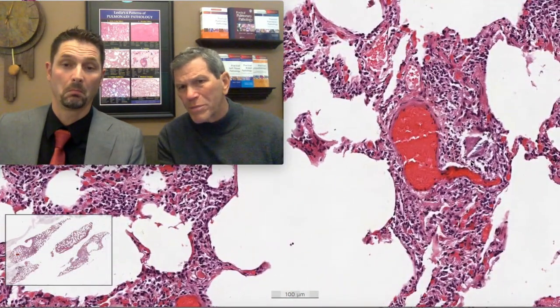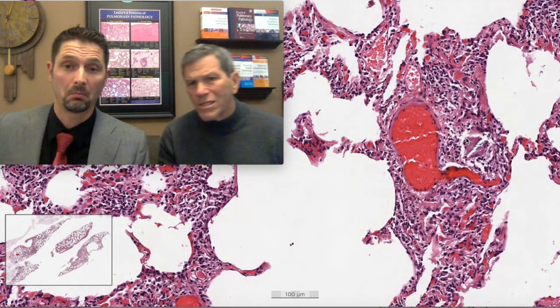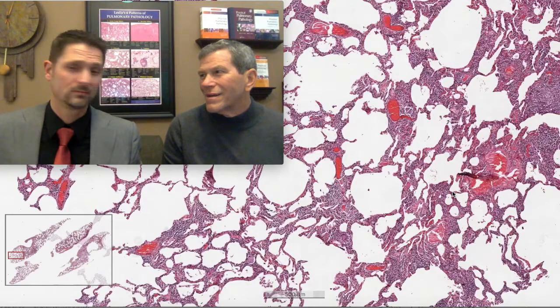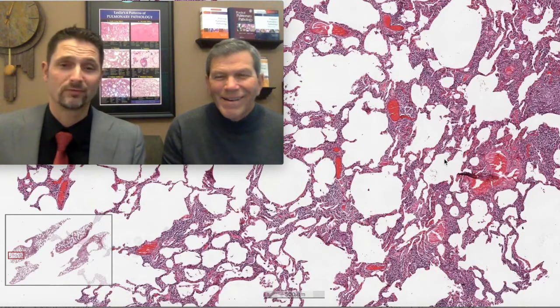And these look like lymphocytes to me, and probably plasma cells. And look at that. Looks like a giant cell right in the middle. That is a giant cell right there. And we've got a lymphoplasmacytic infiltrate. Wow. So hypersensitivity. I mean, do you need to look any further? We've got an alveolitis. We've got a vague granuloma, a giant cell. She probably owns a bird. Perhaps owns a bird. There's another vague granuloma there.